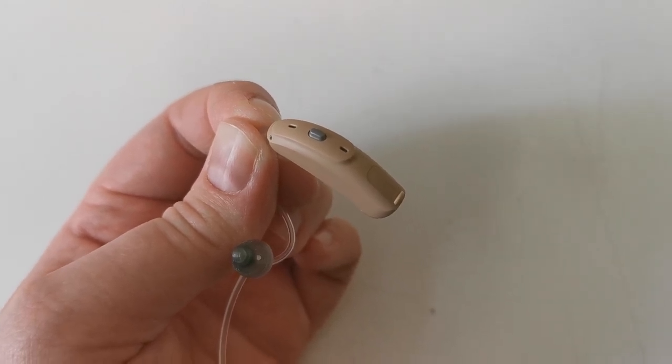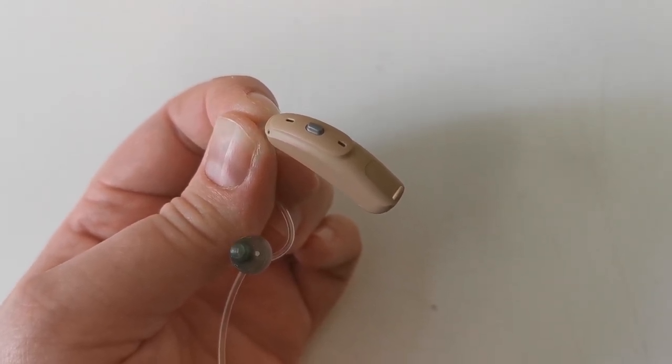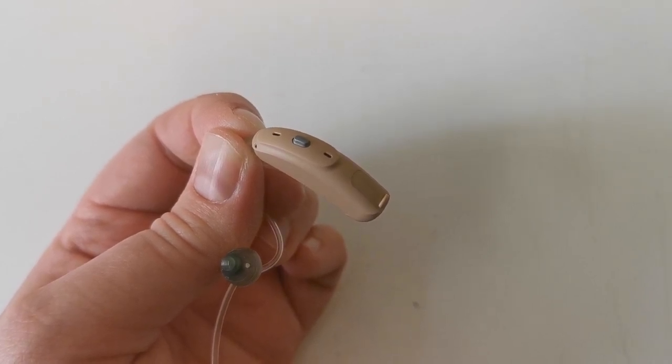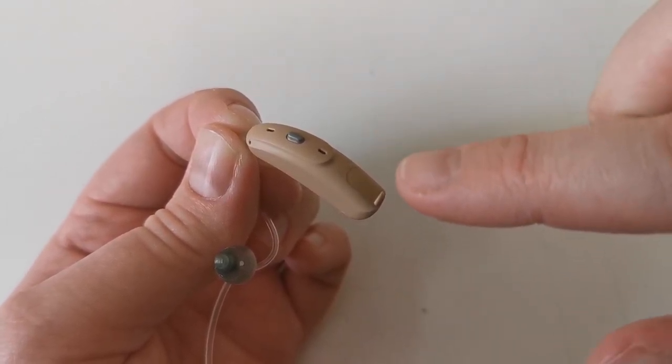In this video we will show you around the hearing aid. The beige part of the hearing aid is what sits behind your ear.